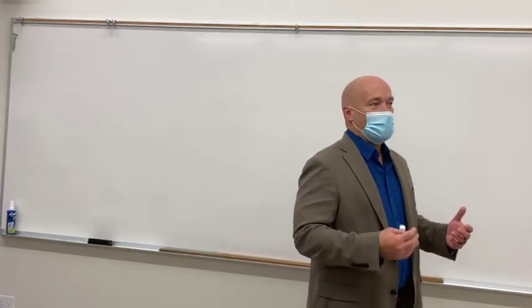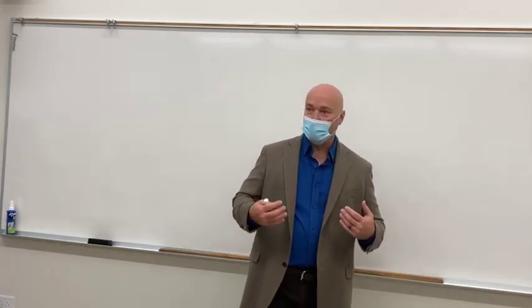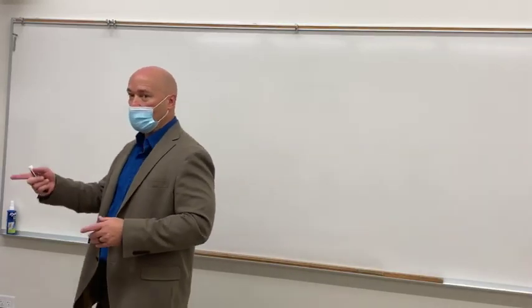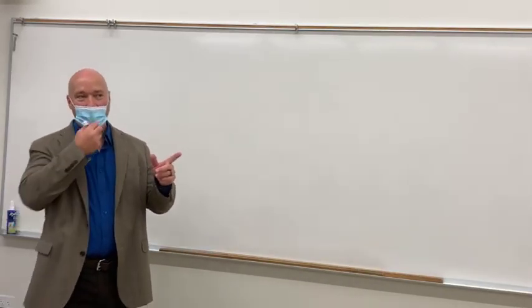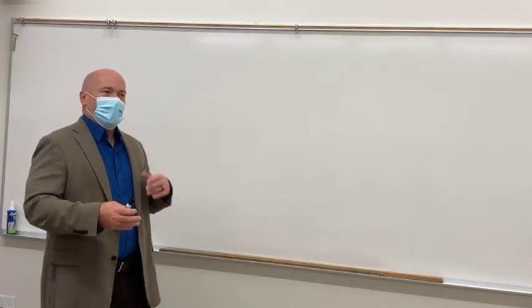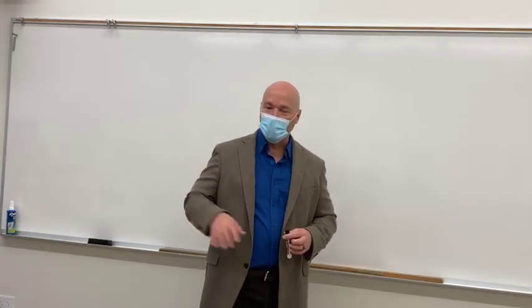Not much, right? An x-ray beam that doesn't penetrate, for our purposes, has no quality at all. So equate KVP with quality. The higher the KVP, the higher the beam quality. That doesn't necessarily mean the higher the x-ray image quality. We'll get into that later on, but think of KVP as beam quality, and we'll talk about why in a bit.